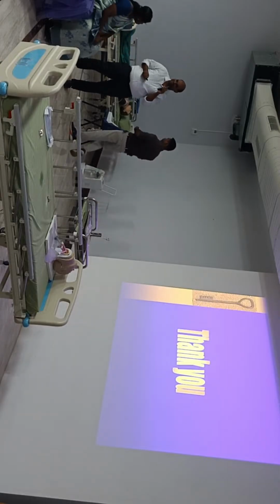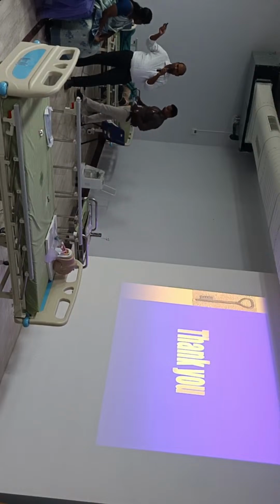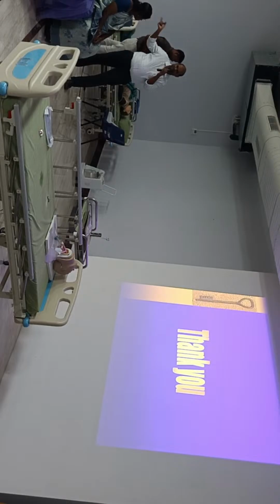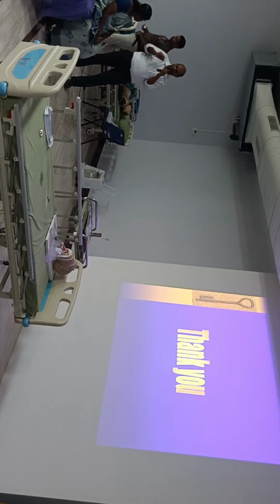Most of the time it is a central suction. Our question was what should be the suction pressure. Most hospitals use central suction, and that is what we use in our hospital. If you are using an individual machine, it should be less than 100, not above 200. The more you suck, the secretions are going to be very minimal. You are not going to expect liters there. So ideally it should be less than 100, definitely not above 200.